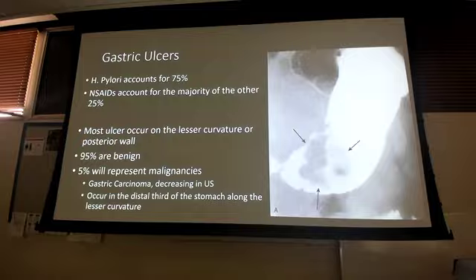So you drink more barium because just a little bit for the esophagus, the barium swallow, is not going to be enough once it spreads out in the entire small bowel. So you get some of these more filled stomachs, and then when you get the picture, you're like, well, that's so much barium in there, the whole thing should look like this. But now I have these filling defects. Those are my ulcerated areas of the stomach. Get those filling defects in there, okay? All right.